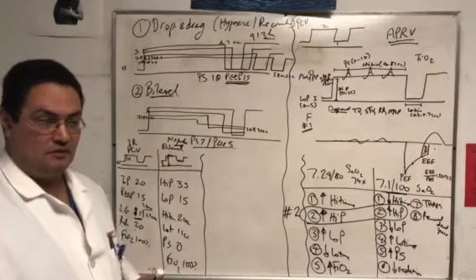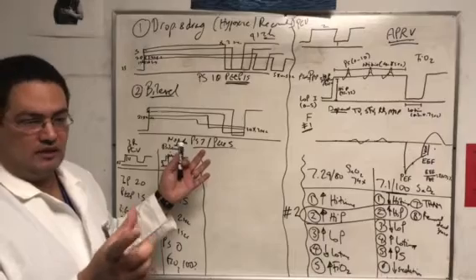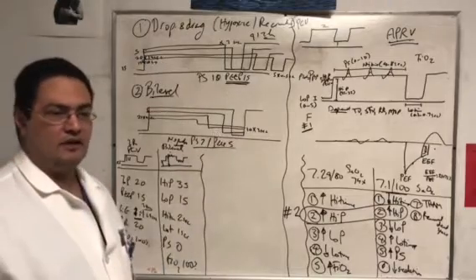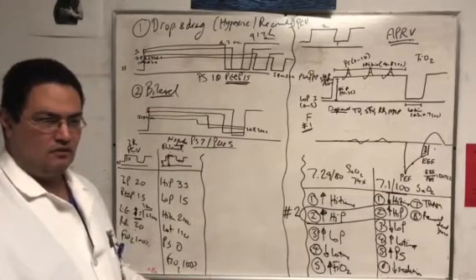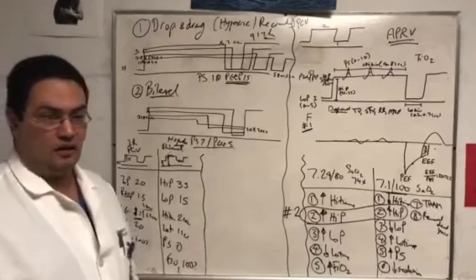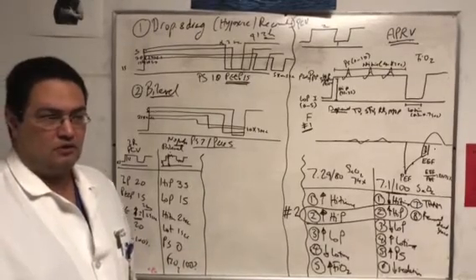Another mistake can happen, which is, let's say I'm still with bilevel, low time more than 1 second, right? But the high time is 9 seconds. Still the same thing is going to happen to a lesser extent, right? There is a good venous return during the 1 second, 1 second and a half, but the majority, I'm giving 12 seconds on the high pressure and 1.5 seconds. Also, that's dangerous. I don't want my patients to have that.